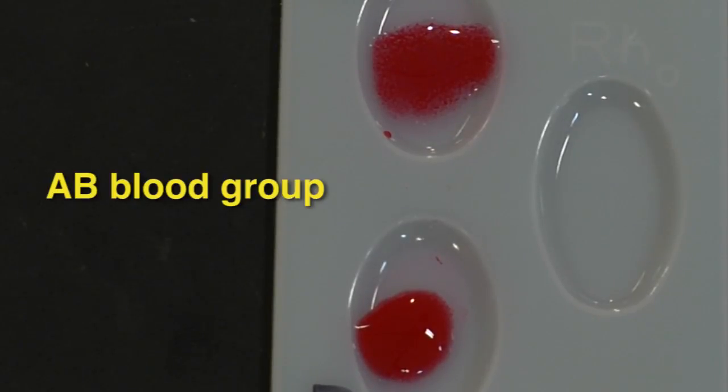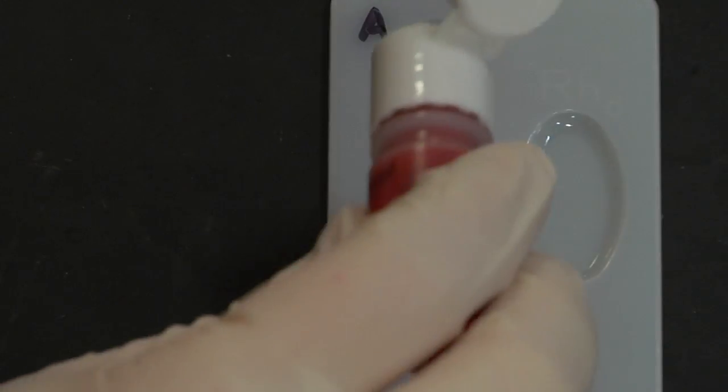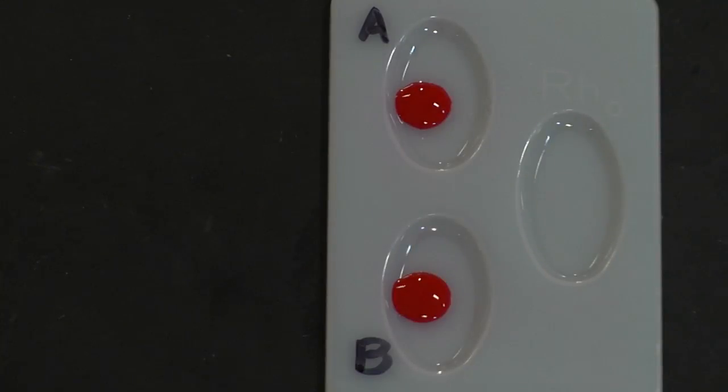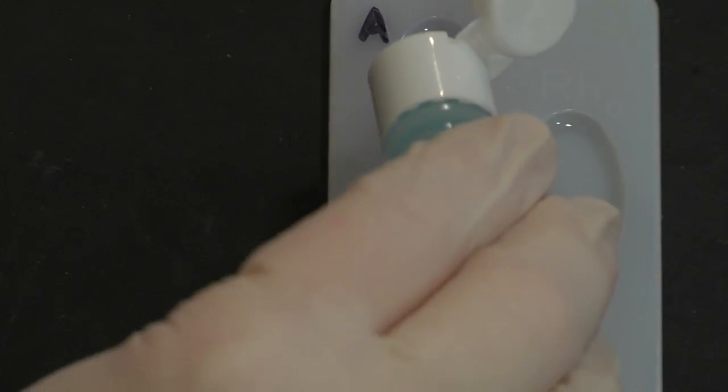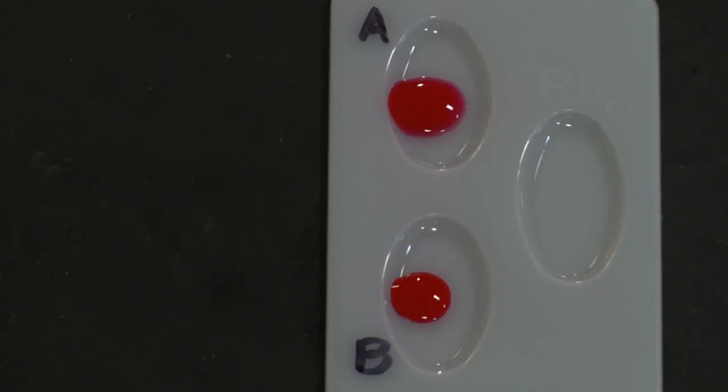Let's test another one. Now we are following the exact same procedures as before. I will place one drop of the second blood sample into each well. Then I'll place a drop of the anti-A serum into well A and a drop of the anti-B serum into well B.